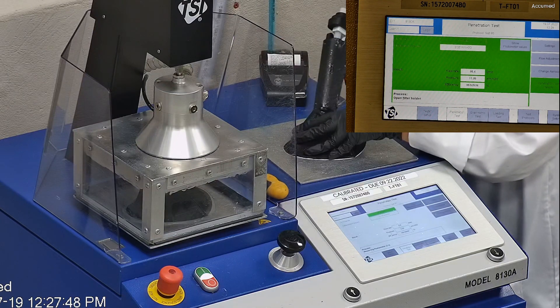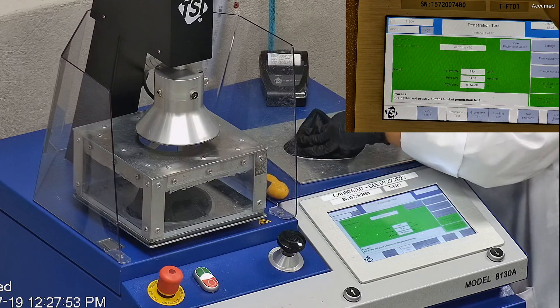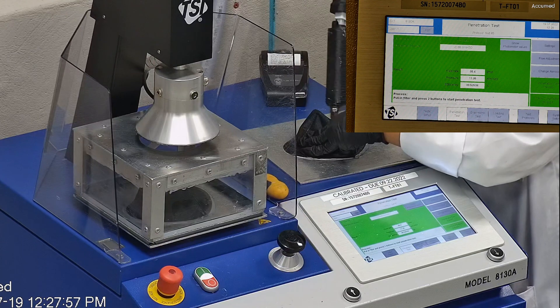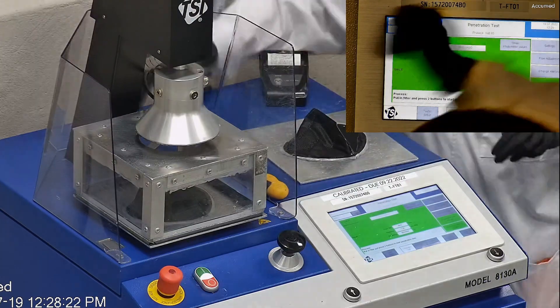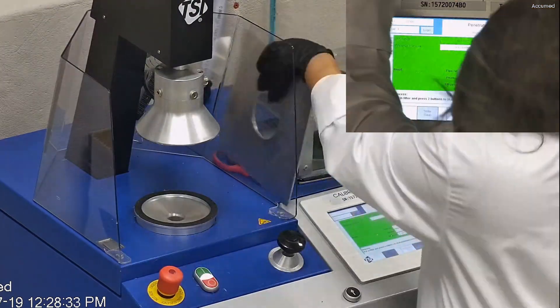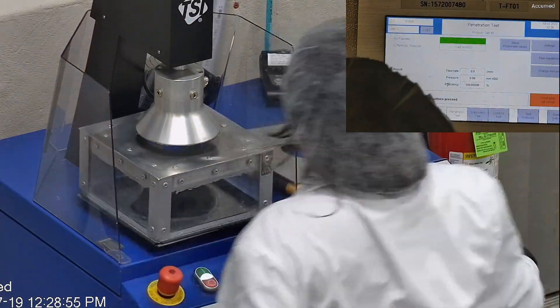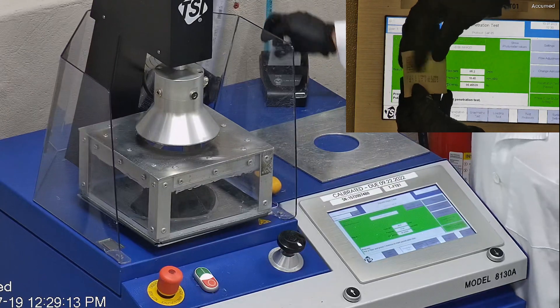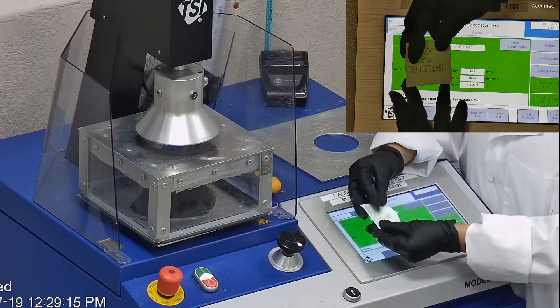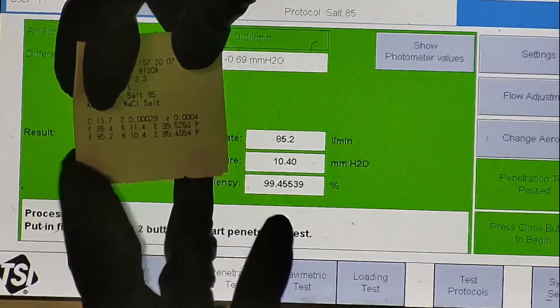The first sample had a filtration percentage of 99.52 with a pressure drop of 11.4 millimeters of water. The second sample had a filtration percentage of 99.46 and a pressure drop of 10.4 millimeters of water.